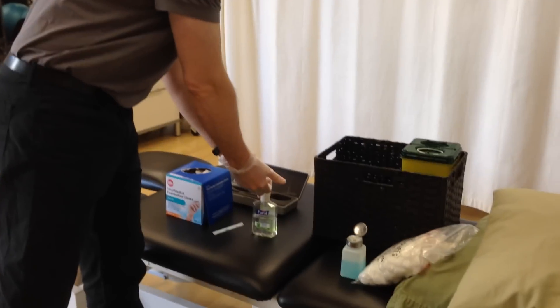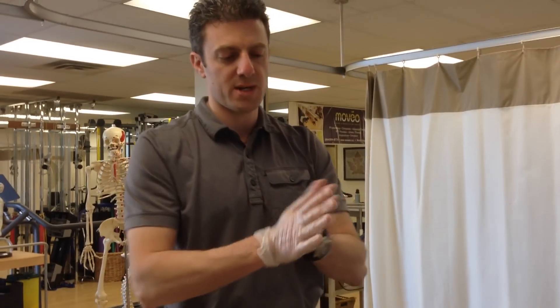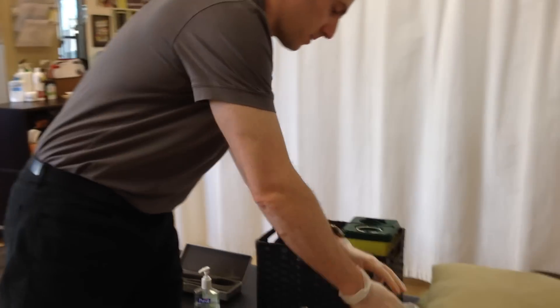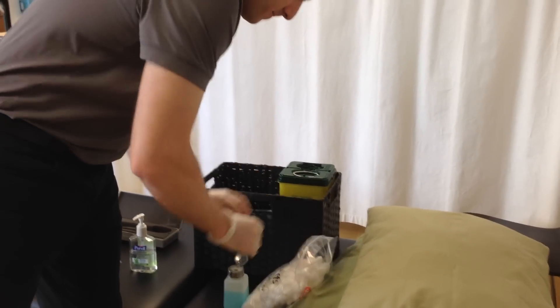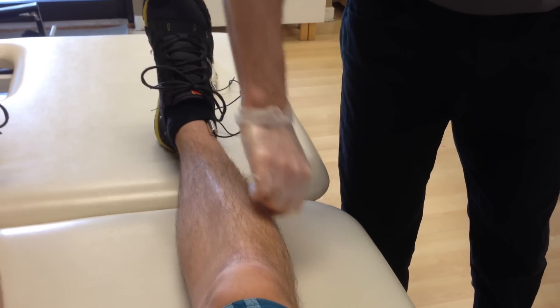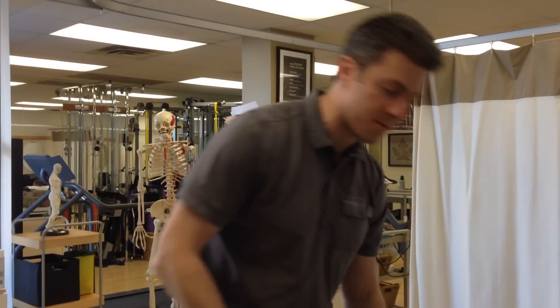I'm going to start by cleaning my hands. As you notice, I'm wearing gloves. Very important to protect both yourself and the patient. I'm going to grab a cotton ball in the area that I'm going to be working on. I've already checked to see that he has tight peroneals — those are the muscles that are responsible for everting your foot.